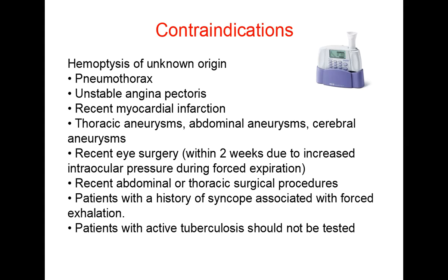Also avoid it in patients with a history of syncope associated with forced exhalation. Patients with active tuberculosis should not be tested with spirometry.